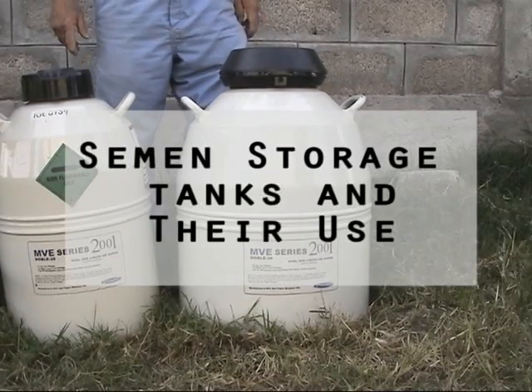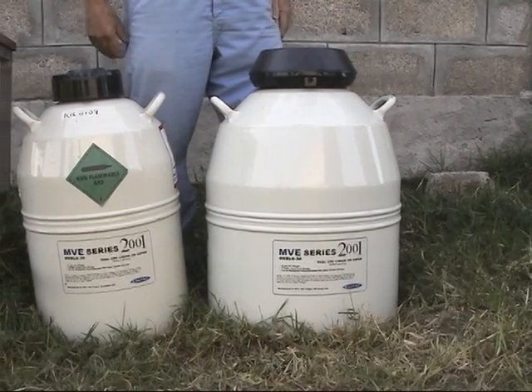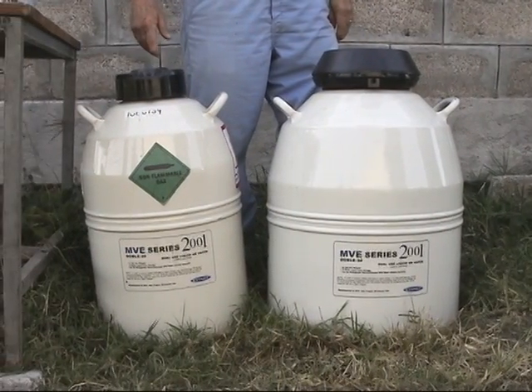The next piece of equipment that we will describe, which is very important in an artificial insemination program, is called the semen storage tank.